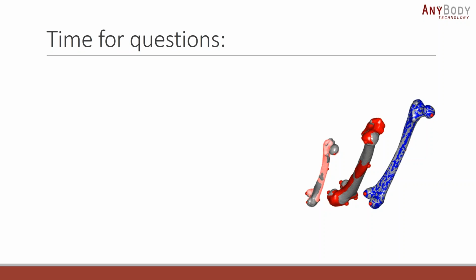Great, thank you. I have a few questions over here as well. Someone here is interested in knowing what are the best set of external landmarks. So you mentioned selecting a set of points on the bone in your model, and then a set of corresponding points on your medical image. Is there an optimal set of landmarks that you would recommend for each individual bone? Does such information exist somewhere?